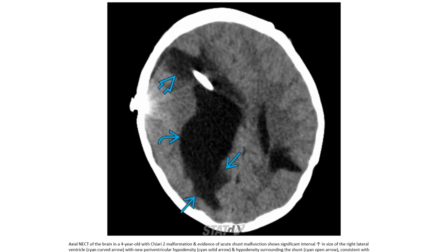This is the non-contrast CT of the brain in a four-year-old with Chiari malformation and evidence of a shunt malfunction, showing significant interval increase in the size of the right lateral ventricle with a new area of periventricular hypodensity and hypodensity surrounding the shunt, consistent with shunt malfunction.